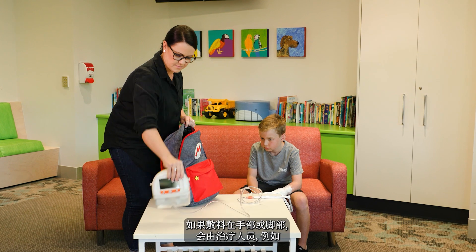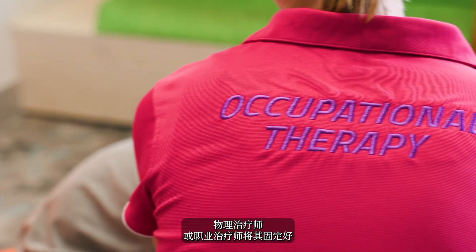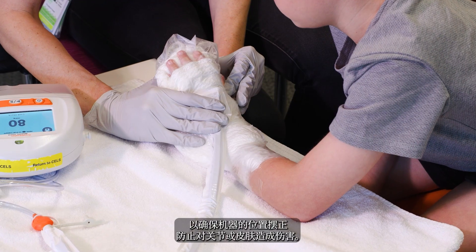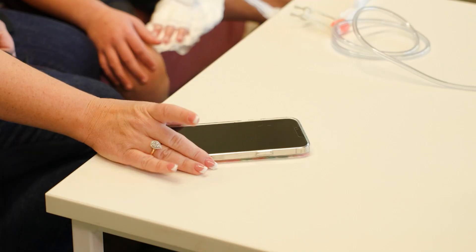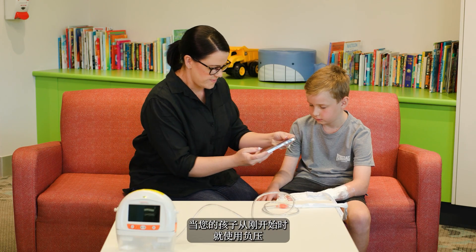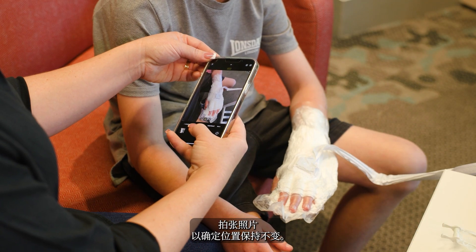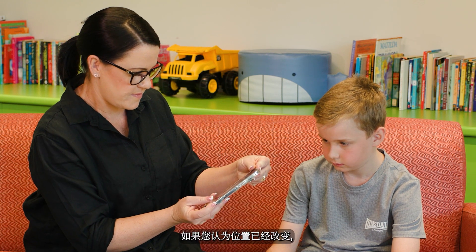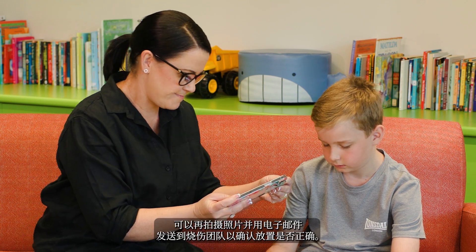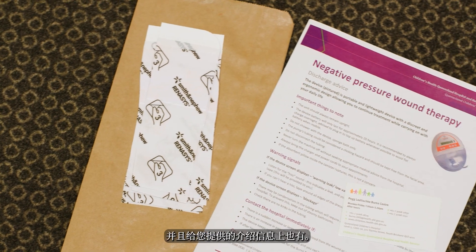If the dressing involves a hand or foot, it has been positioned by the physiotherapists or occupational therapists to ensure it is in the correct position to prevent any harm to the joints or skin. When your child has initially had the machine placed, it may be helpful to take a photo of your child's limb to ensure the position stays the same. If you think it has changed position, you can take a photo and email it to the burns team to confirm the placement. The email address is on your appointment card and also on the educational handouts you've been given.